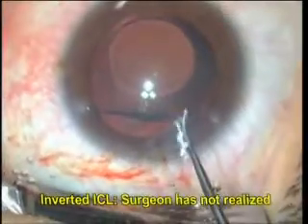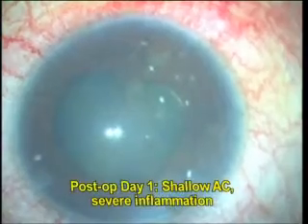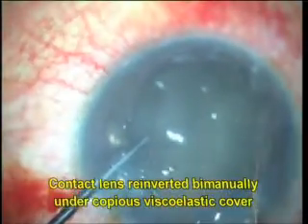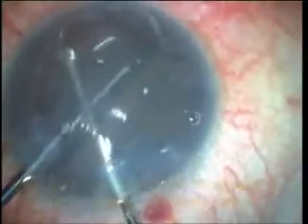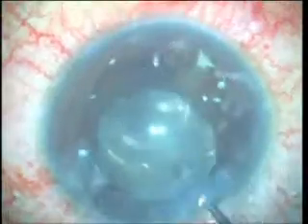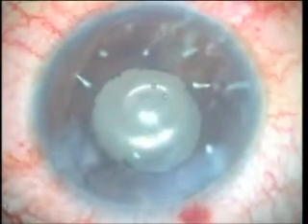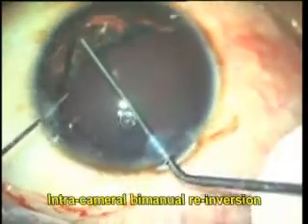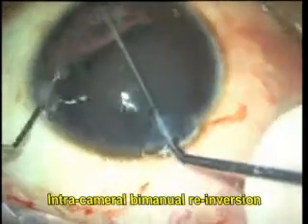A flipped ICL may also give rise to post-operative inflammation and must be corrected. The technique of viscocannula-assisted re-inversion of ICL should be performed very carefully while making sure at all times to avoid contact with the endothelium or the lens capsule. An inverted ICL may also be tackled by explanting the IOL and re-implanting it.